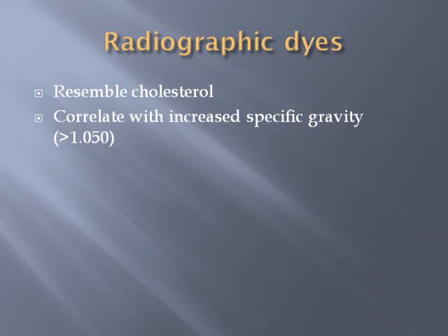Radiographic dyes can resemble cholesterol crystals. Usually you kind of know if the person just had a radiographic dye test. They correlate with increased specific gravity.